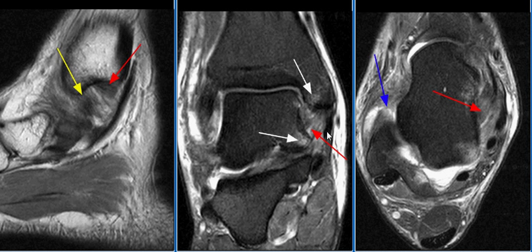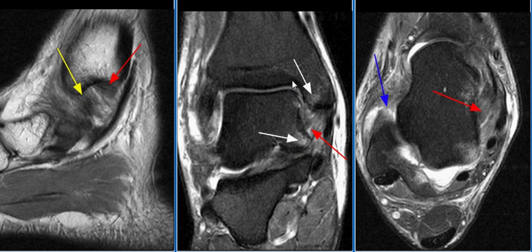There is edema within the anterior and posterior tibiotalar ligaments, as seen on these images with red arrows. The anterior superficial fibers of the deltoid ligament are intact. There is reactive edema within the medial malleolus and medial talus at the deltoid ligament attachment sites, as indicated by white arrows.